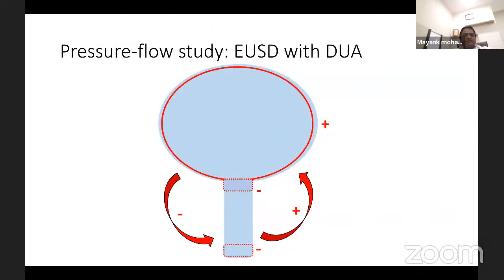Now, coming to when it is not in the outlet obstruction range, then how to rule out obstruction, like in detrusor underactivity cases. So, what will happen in a patient with sphincteric dysfunction? Now, this sphincteric dysfunction is a very interesting topic, and if you can understand this doing a urodynamic study, you have really taken care of a lot of patients, young up to middle age, who come with this problem and get unnecessary TURPs or dilatations or whatever.